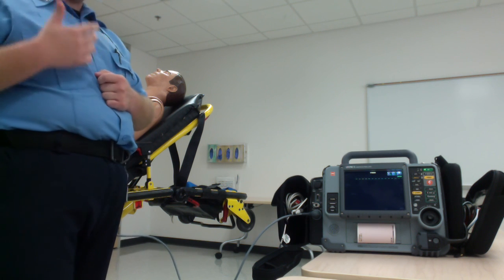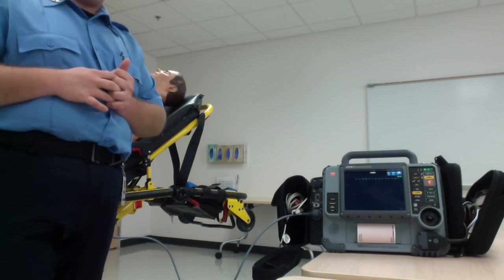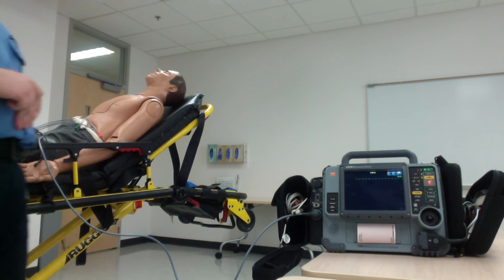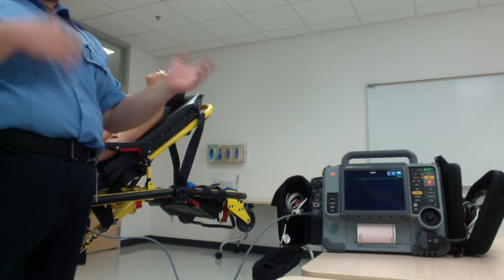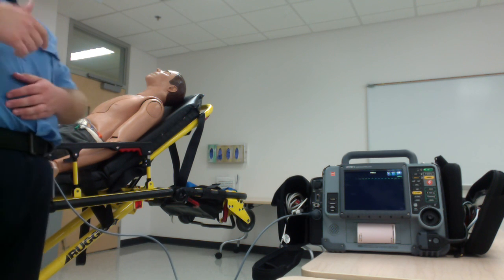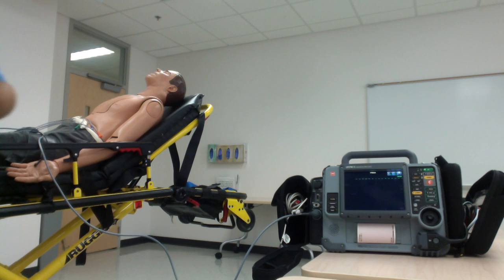That way it's not you interpreting it, since the only people here in North Carolina who can actually interpret the 12 lead in the pre-hospital setting are paramedics. In the hospital, I'm sure a doctor can, and they have a full list of who in the hospital can actually interpret the 12 lead. But in the pre-hospital setting, the only people that can legally interpret it are paramedics.